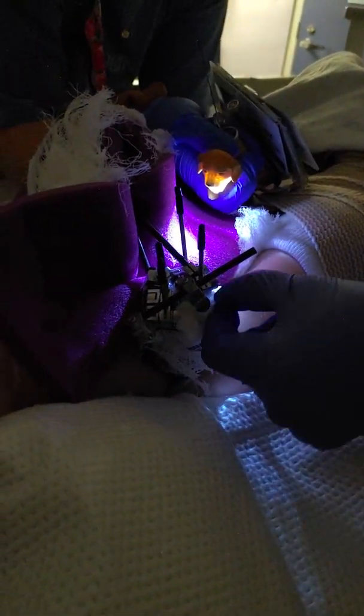Okay, he's saline. Yeah, I can grab some. Thanks, because some of this is going to be a little caked, and I don't want to have to be pulling it off of him.